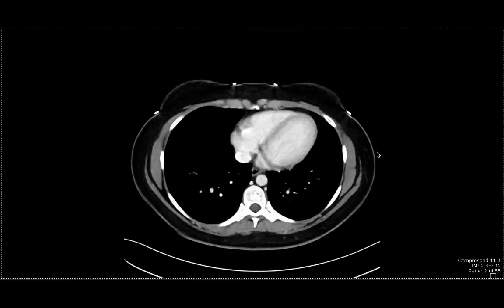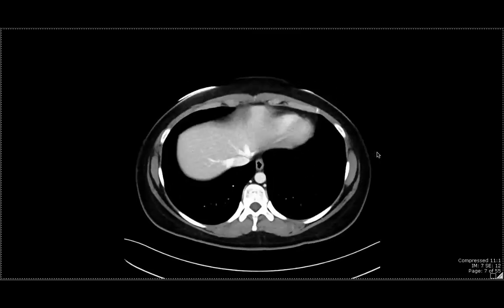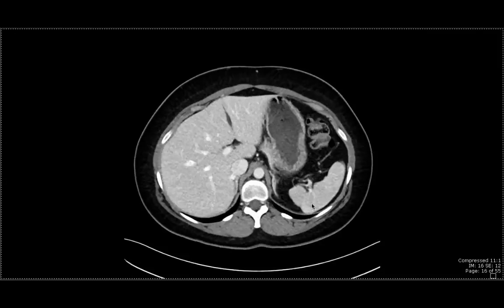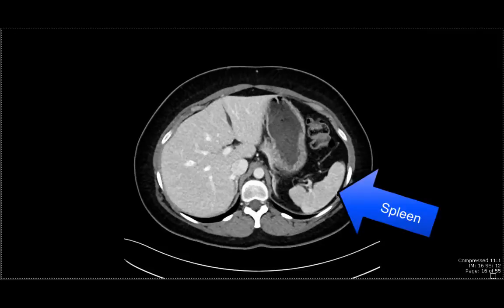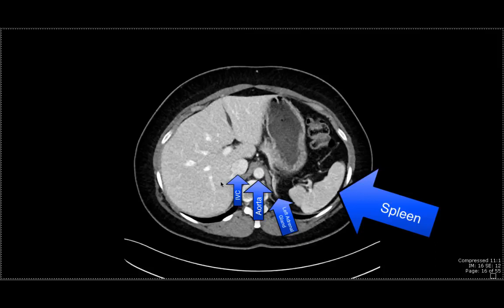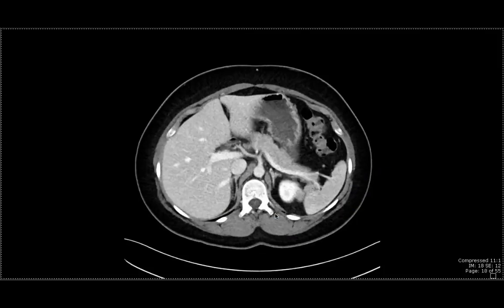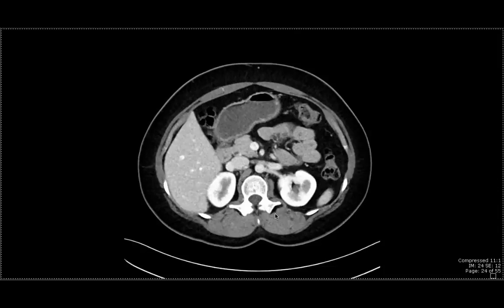The first organ I'd like to showcase is the spleen. We can see the spleen over here in the left upper quadrant. On this image, we can also see a portion of the left adrenal gland, the aorta, the inferior vena cava, as well as a portion of the liver. Over here is the stomach. I'll continue to scroll downwards to give you the full extent of what the spleen looks like.